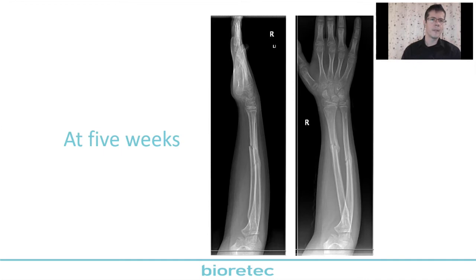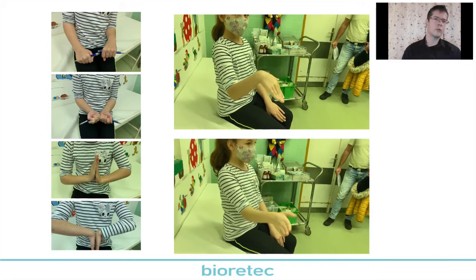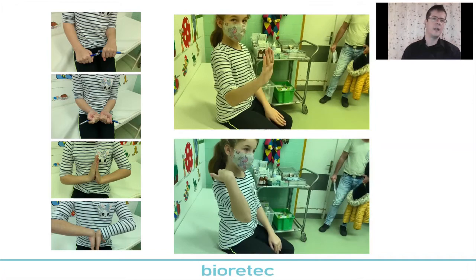And here we can see the pictures after 5 weeks. Please, next slide. And here we can see the function after 5 weeks, almost total movement of the forearm, or total no restriction and no pain, and there will be no need for implant removal. Next slide, please.